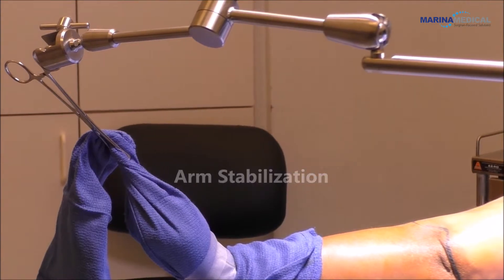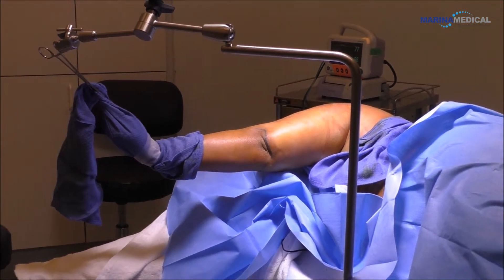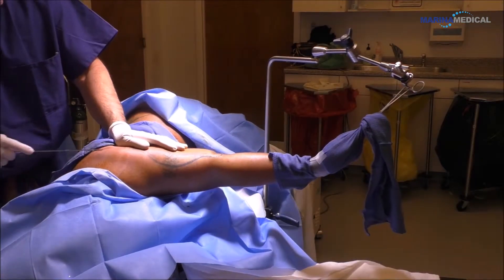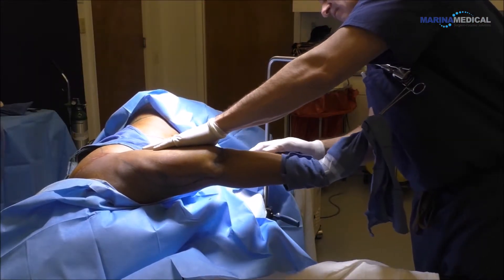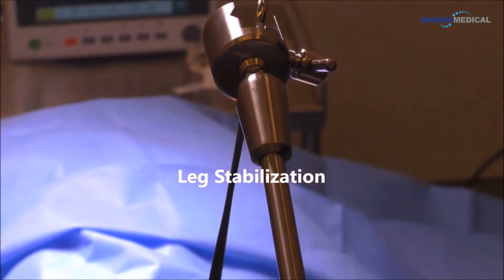So I put a towel on the hand, I put a clamp on the towel, and I put the towel on the robotic arm — and now I have an assistant for the hand that never gets tired. My assistant is now sitting there just doing chart work, giving medications. For the leg, same thing.